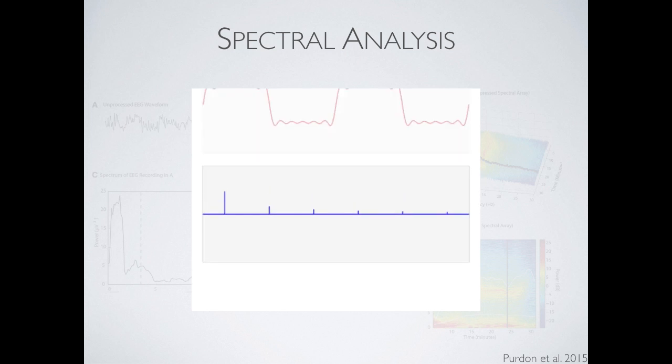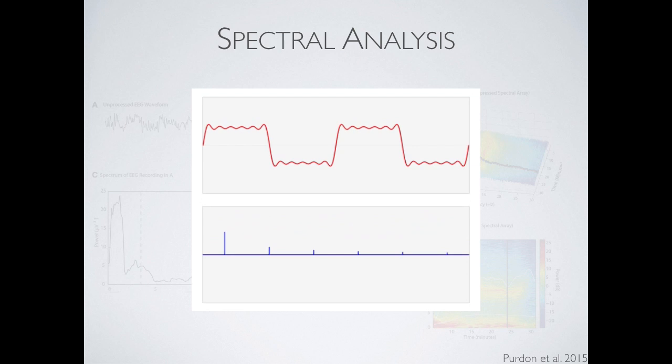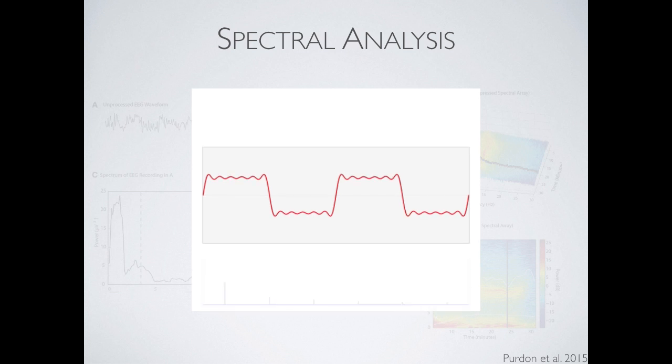That's actually something that's pretty common in brain signals. It's what's called a 1/f power spectrum, meaning that the higher the frequency, the lower the amplitude, which if you're a physicist, you would associate with something called pink noise. I can send some follow-up if anyone's really interested in the details. And if you're interested in the math, I have some good review articles that I'd be happy to send.